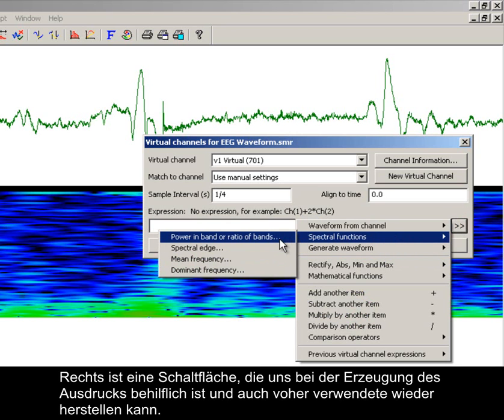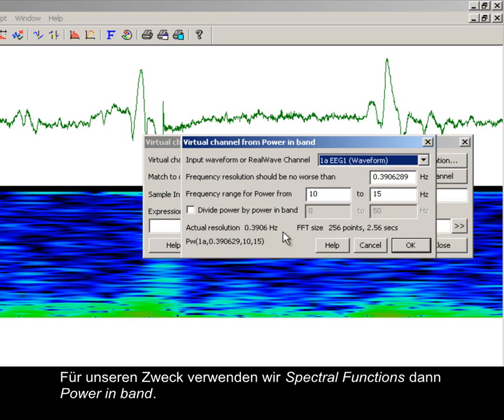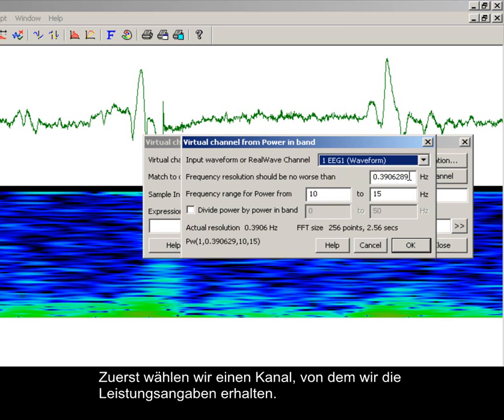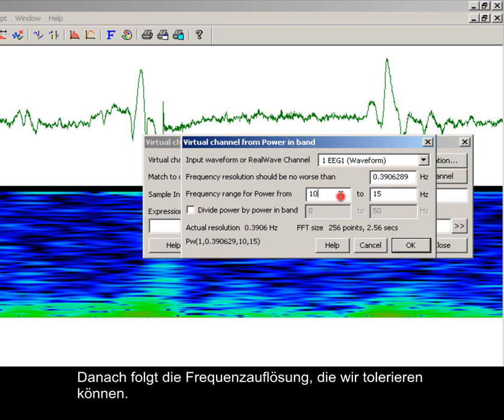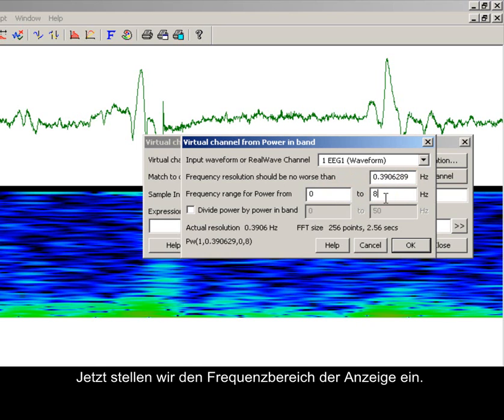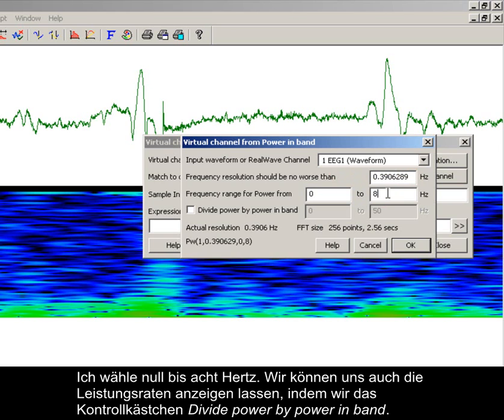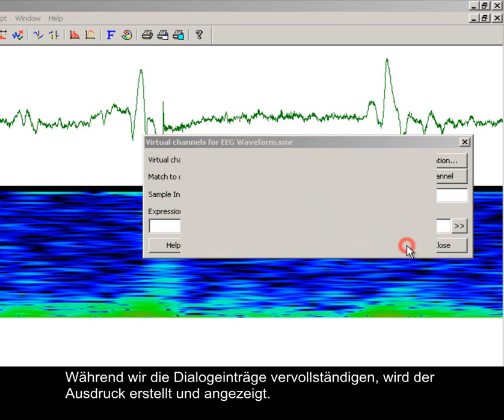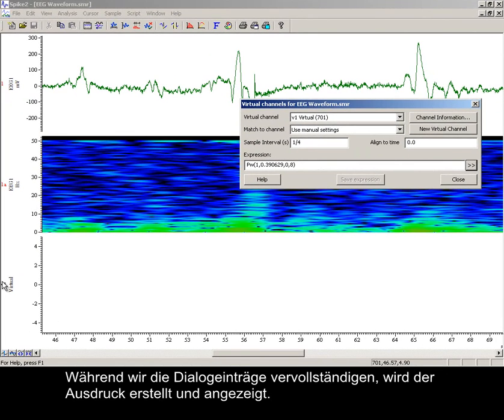On the right is a button to help produce the expression and also restore previously used ones. For our purposes, we use spectral functions, then power in band. First we choose a channel to obtain the power information from. Next is the frequency resolution that we can tolerate. Now setting the frequency range — I'm using 0 to 8 Hz. We could also see a ratio of powers if we select the checkbox for divide power by power in band. As we complete the dialog entries, the expression is being built and displayed.